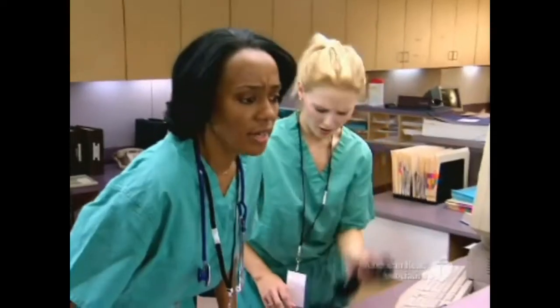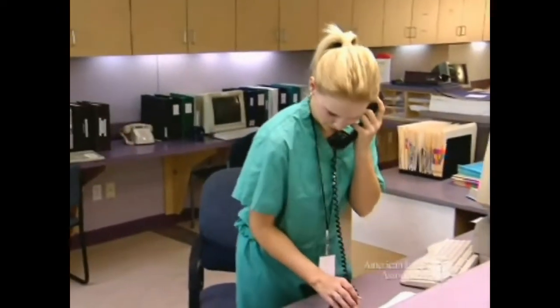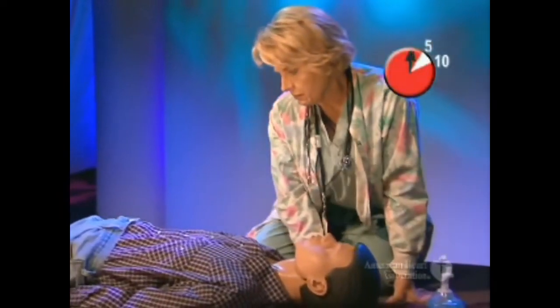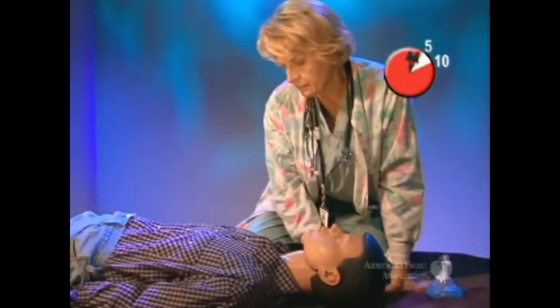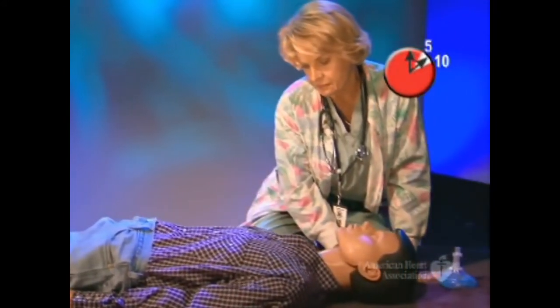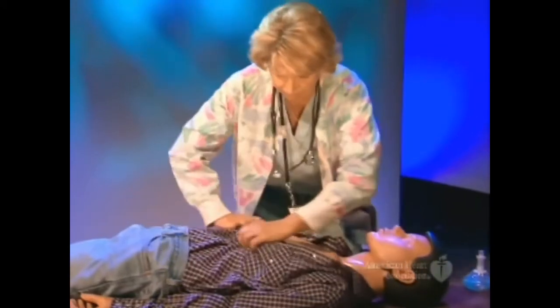While another rescuer goes to activate the emergency response system and get the AED, check for a pulse. And if you do not definitely feel one within 5 to 10 seconds, quickly move or remove the clothes from the front of the chest that will get in the way of providing chest compressions and apply the AED pads.